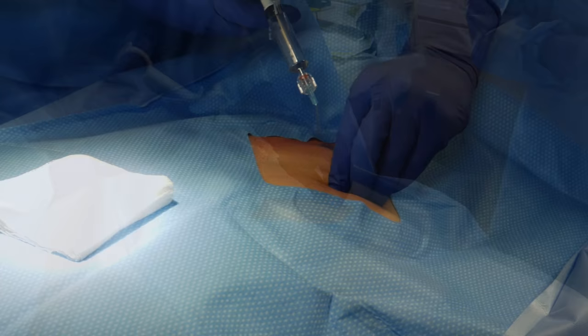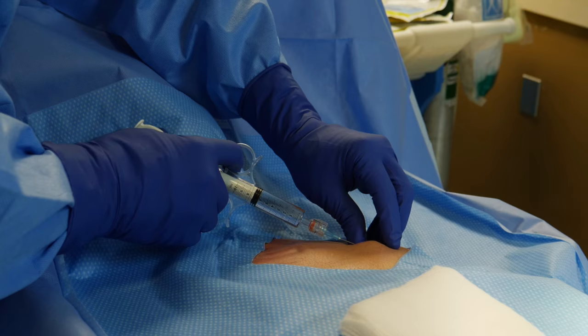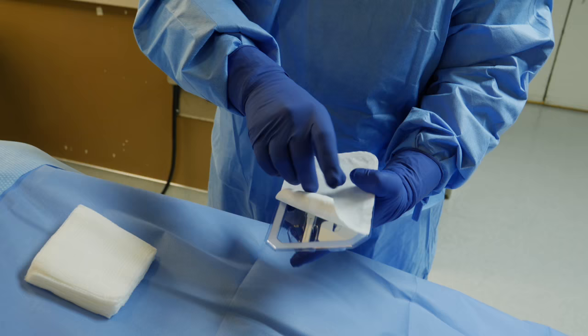We take a pinch of skin and from the base of that pinch of skin we infiltrate lidocaine, or numbing medication, 10 cc's total, along that insertion track so the patient will feel nothing while we insert the implantable monitor. Here we are infiltrating the lidocaine nice and slowly, making sure we numb thoroughly below the skin as we progress.